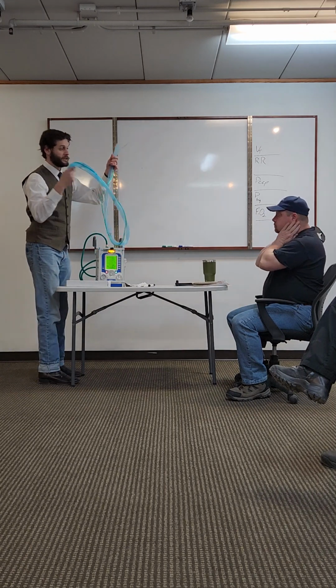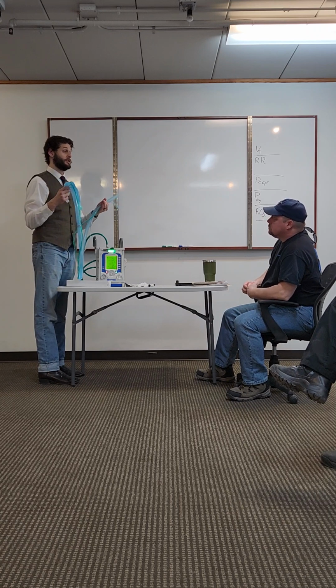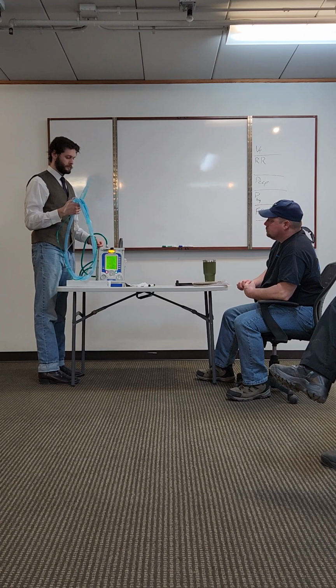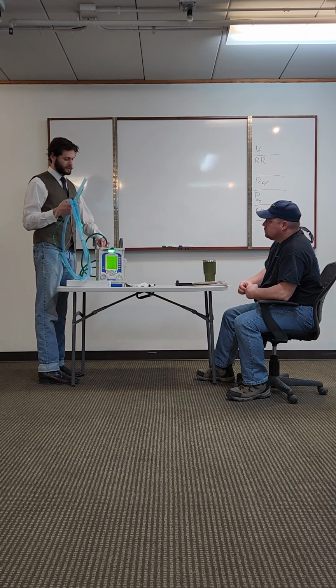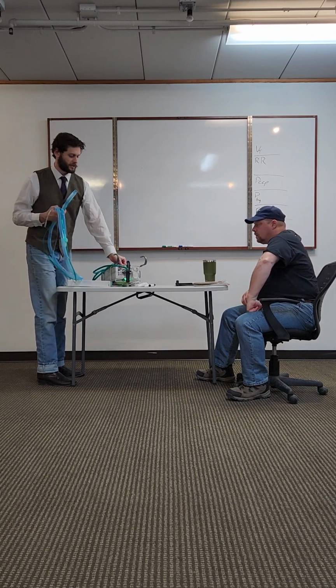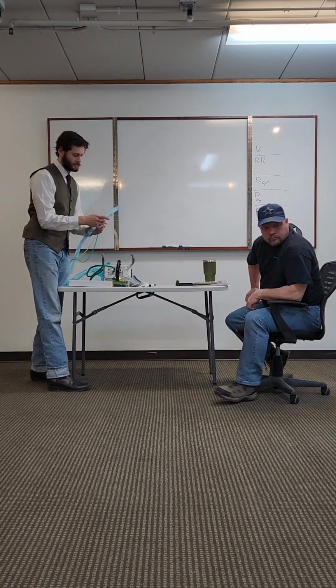So with this, you have to use a Z-Vent circuit. You cannot use a Newport vent circuit. You can't even get a Newport circuit to fit on here if you wanted to. The exhalation valve and proximal line hoses do not fit on the hoses on the Z-Vent. So, looking at the top, you've got your gas tube.